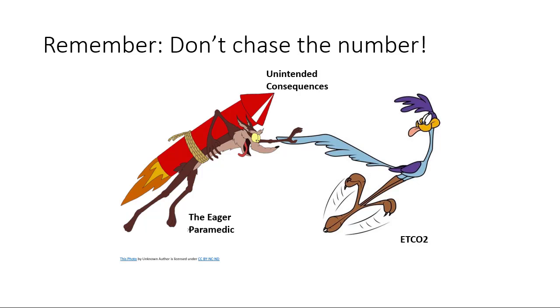They would bag at 30 or 40 breaths a minute, trying to get the end-tidal CO2 down to what they think is a normal range. In doing that, you can cause air trapping and barotrauma. Another example would be head injuries.